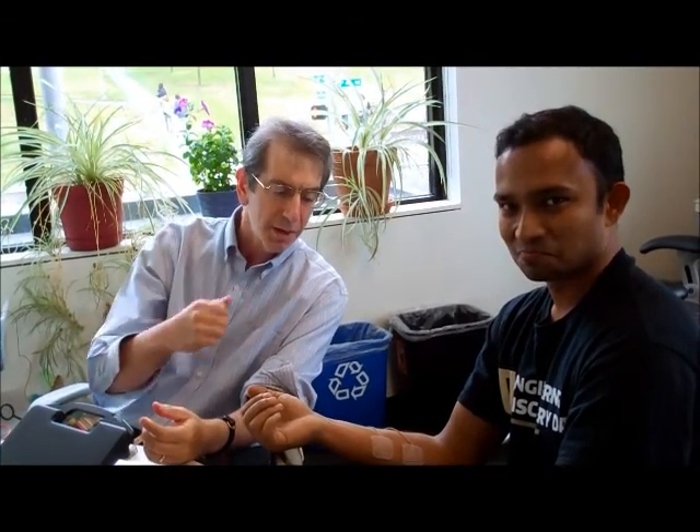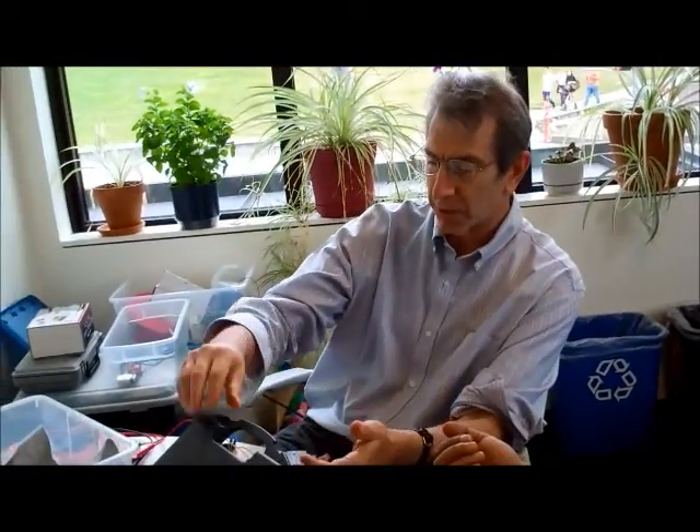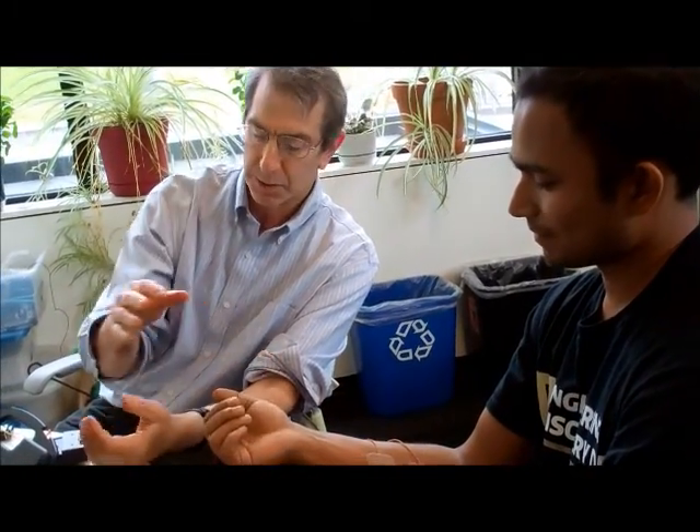We're demonstrating how to use an EMG of one person to control a muscle of another person. We have a TENS unit — a transcutaneous electrical nerve stimulator — which is connected to an Arduino. We've preset the intensity of the stimulator such that we can get a contraction of the muscle here.